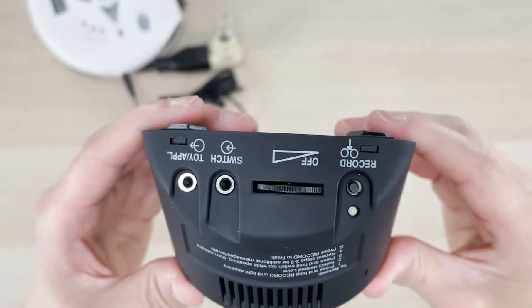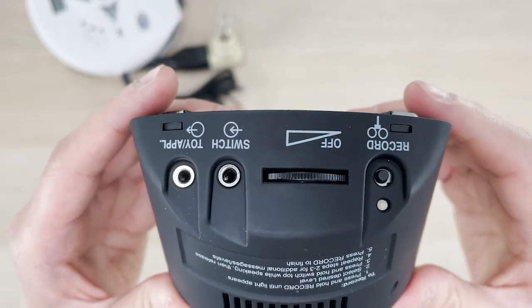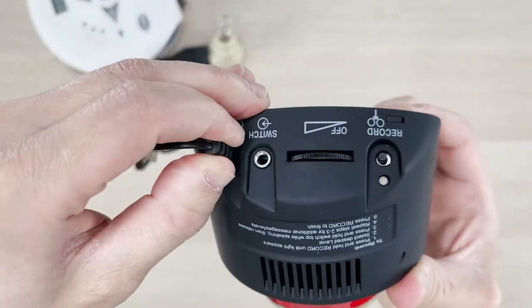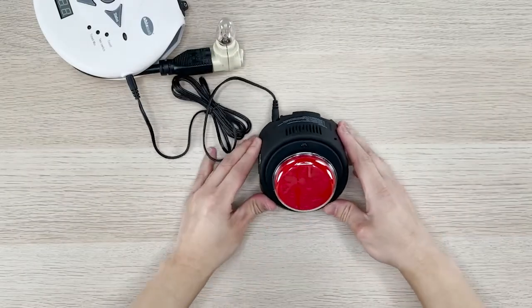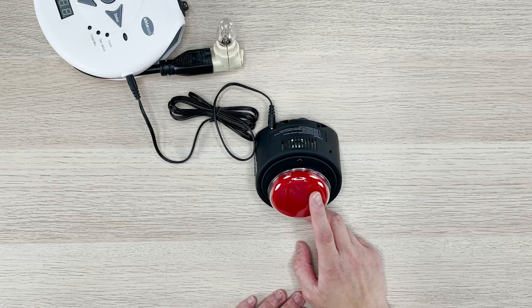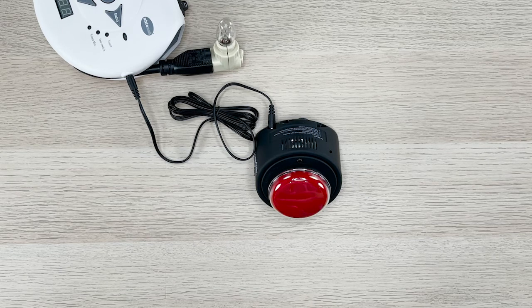To check that we have successfully assigned a message to activate our external appliance or toy, we will need to connect an external appliance or toy to the toys and appliance output. By activating the message, the appliance should be activated as well with the duration of the message. Turn on light. There you go — we have successfully set up our little step-by-step here with the message to activate the light.